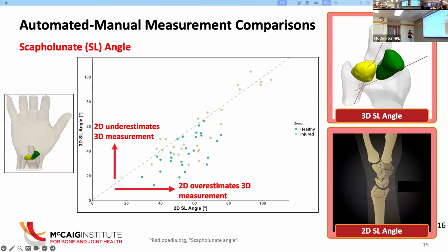And kind of off of Brent's first question about the changes being bigger in the unloaded condition versus the loaded ones: don't you think that the fact that the injured population is so significantly different in the neutral position, but then very similar to the uninjured one in the loaded condition, still tells you that going from neutral to load bearing is a much larger shift than in the uninjured population?